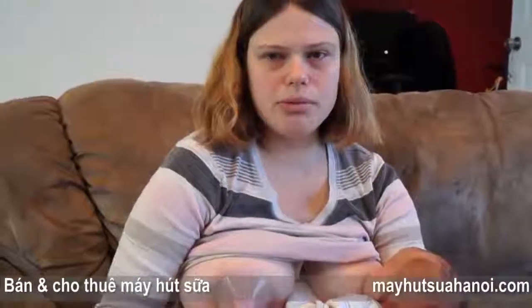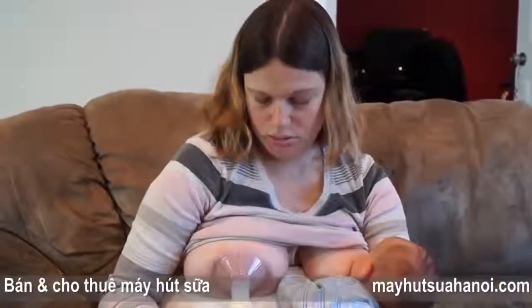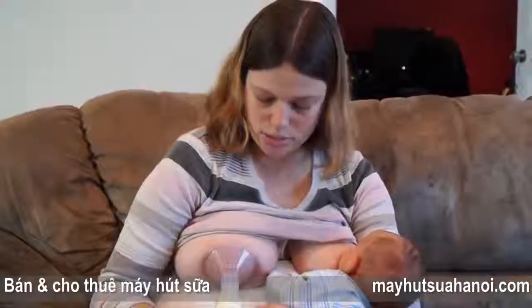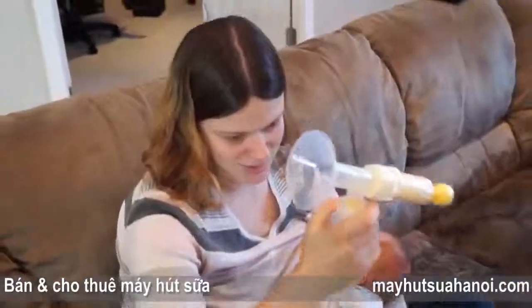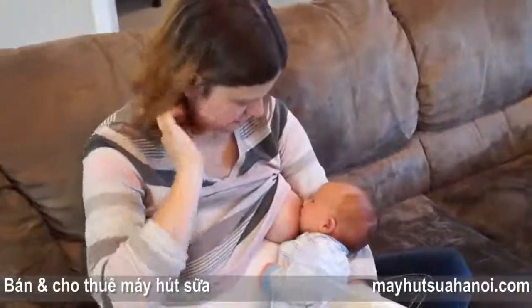You'll want to pump probably 10 minutes, maybe 15 minutes per side, or until you can't seem to get any more milk out, and then you maybe want to pump a minute or two beyond that point to encourage more milk production if you're pumping for supply issues. The baby just fed on this side, so there's not much left. Let's see if I can get some more from the other side.